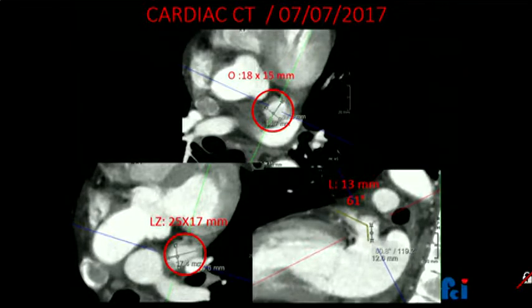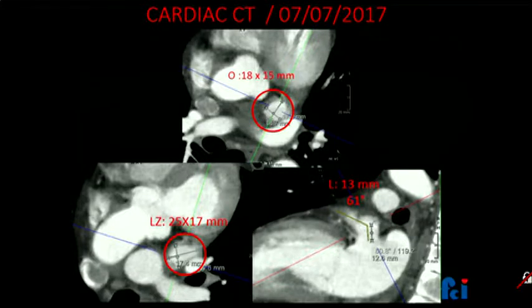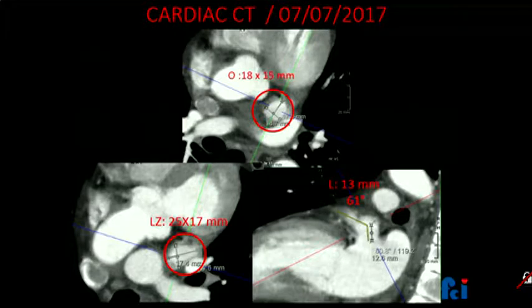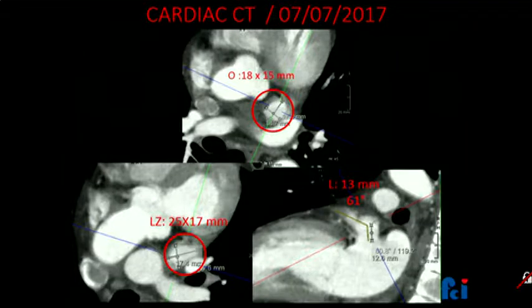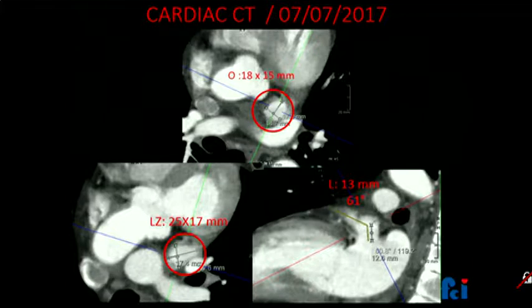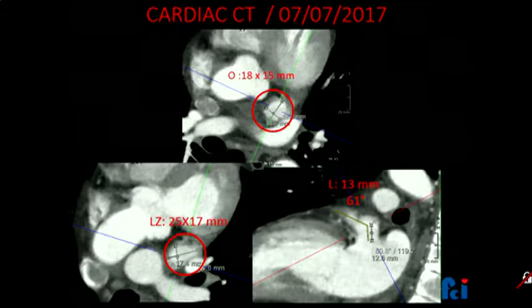On the lower right picture, you can see the distance from the ostium of the appendage to the septum, approximately 51 mm. On a different view, the diameter of the ostium is 18 to 15 millimeters, and here 25 to 17 millimeters. The last view shows the appendage at 61 degrees with a depth of 13 millimeters.